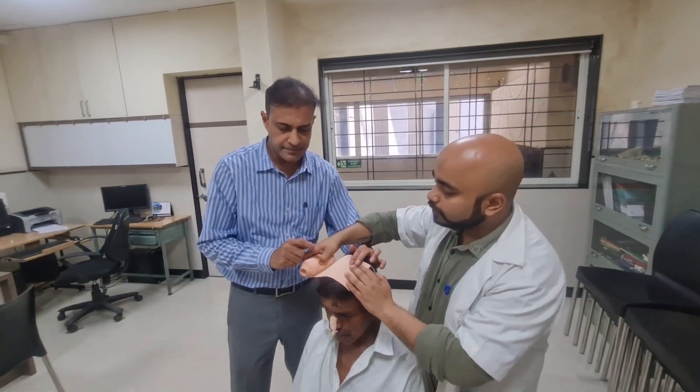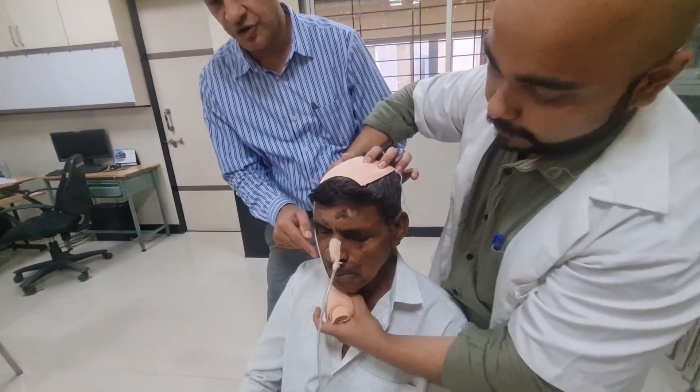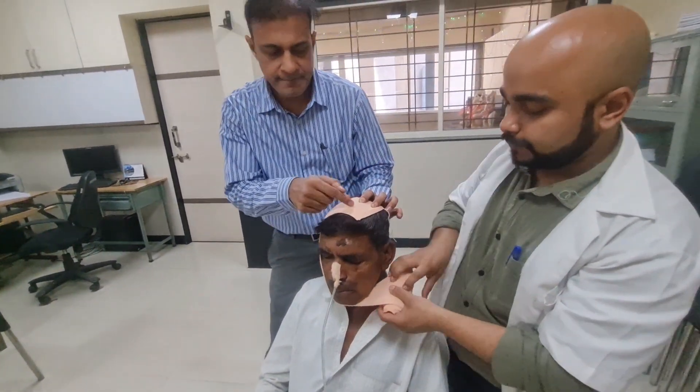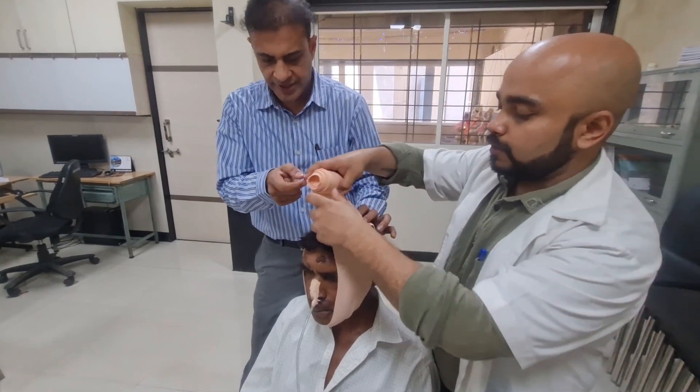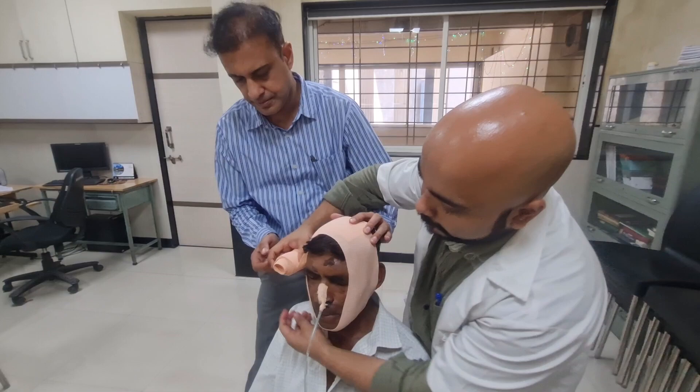The first step is to take the crepe bandage and roll it around the chin of the patient. It goes around — we can take one or two rounds. I am taking two loops to get better pressure.